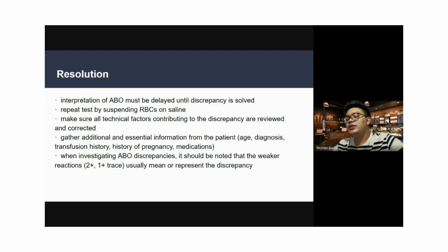Okay? Next is cold agglutinins in high titer. So, ito yung sinasabi ko sa inyo, cold agglutinins. Imagine, IgM nag-react sa room temp. Remember, M, malamig. Cold agglutinins. So, what if high yung titer ng cold agglutinins? Tapos, hindi naman pala dapat mag-react siya during the phase of ABO Rh grouping. Pero nag-react siya because mataas. Mataas yung agglutinins niya. So, cause ng false positive yun.